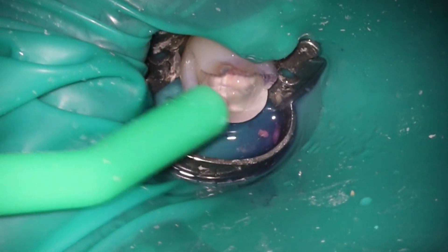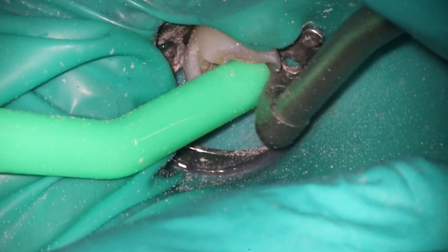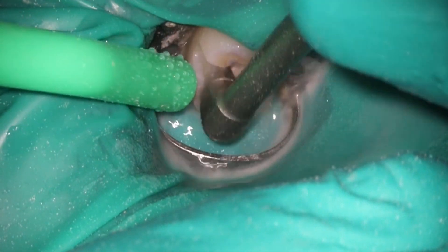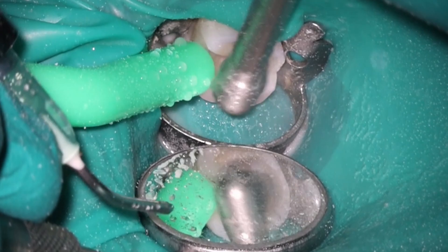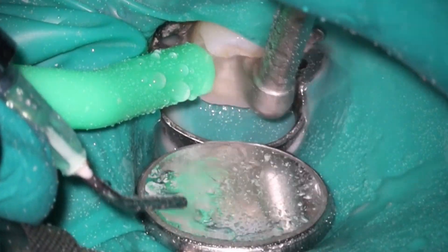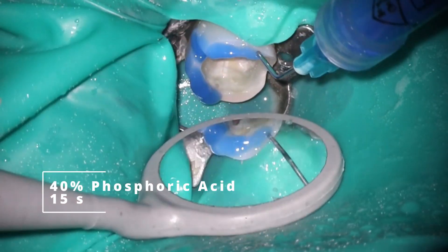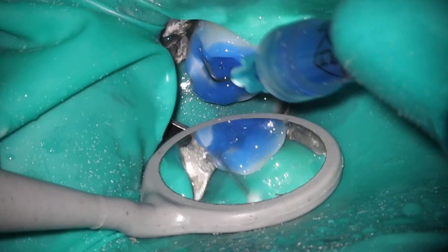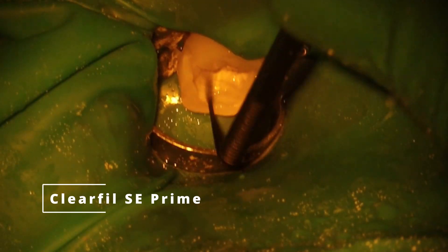So we're going to do the restorative on this one. Nice guy just wants to get his tooth back — he was mostly concerned that he had a big hole in the tooth. One other interesting thing: look at how little bacteria was actually present in there. Obviously we cleaned out all the soft stuff. But this disclosing is letting me know — I have no idea how bacteria actually work, I don't think any of us actually do. You'd think a case that was completely soft, leathery, and nasty would be littered with bacteria that we'd have to blast away, and there's barely any on this. Kind of interesting — which cases have a lot of bacterial activity and which have almost none. It could be that I was doing more rinsing than I would normally, which cleaned out more of the bacteria. I'll keep an eye and see if I can figure anything out.